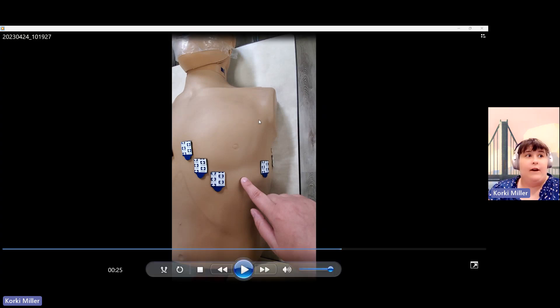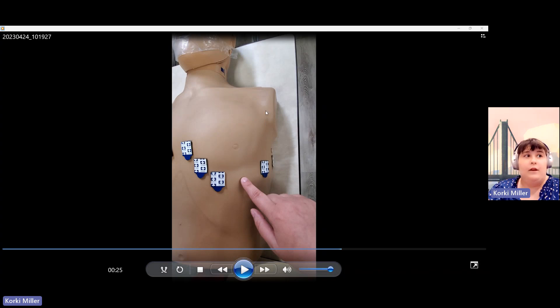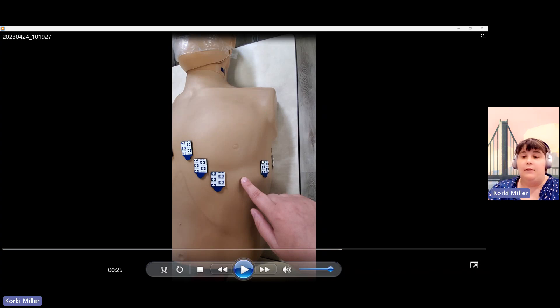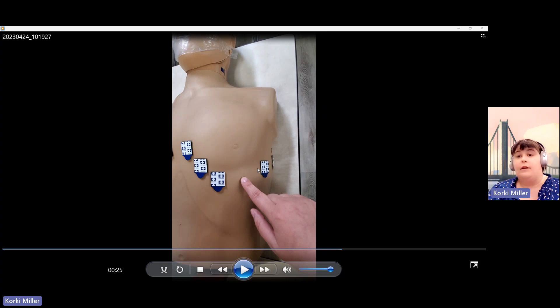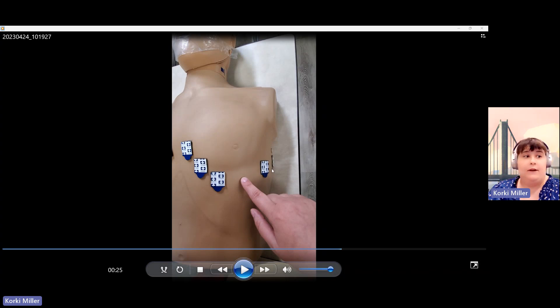So for the V5, your point of reference is going to be the armpits. Looking for the armpit notch right here, and you're going to draw down. But you're also swooping up, because you're following the curvature. Where that armpit and that swoop meets, that's where you're going to put the V5. So right now, there's a wide gap. But on a smaller patient, this gap is not going to be so big. But it's OK, because that's the proper placement of the V5 on this.